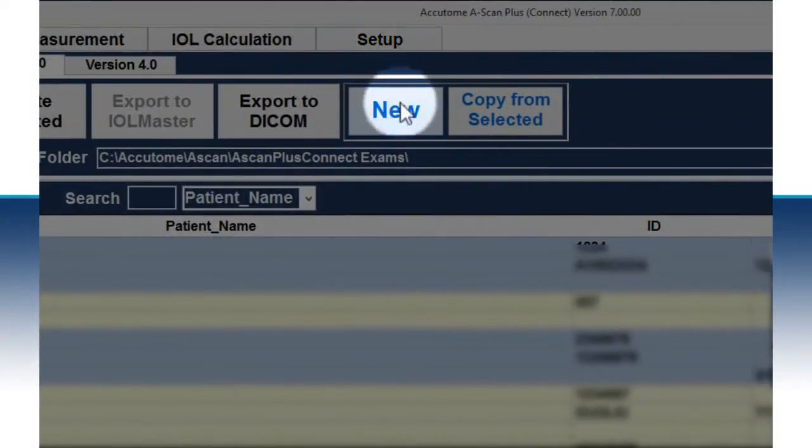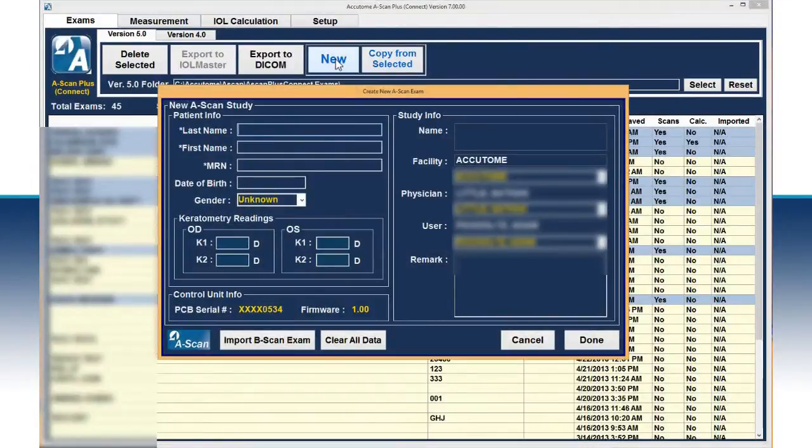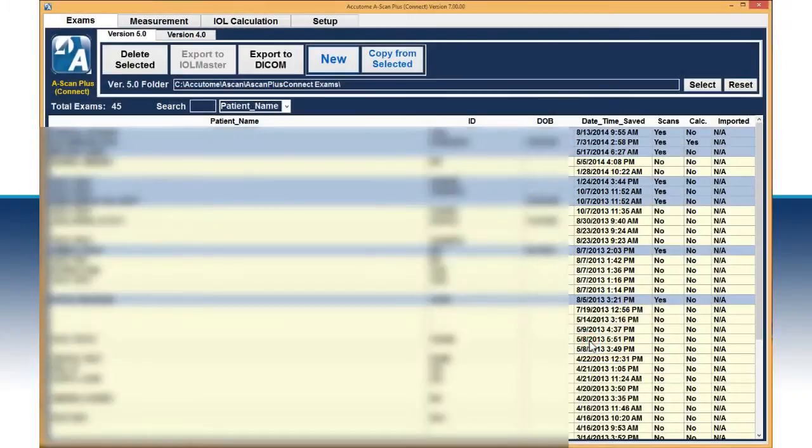On the screen, you see an icon labeled New. To start a new study, click this icon. Fill in the resulting screen with all of the patient's demographic information and press the Done icon at the bottom right. The software will automatically take you to the measurement screen.